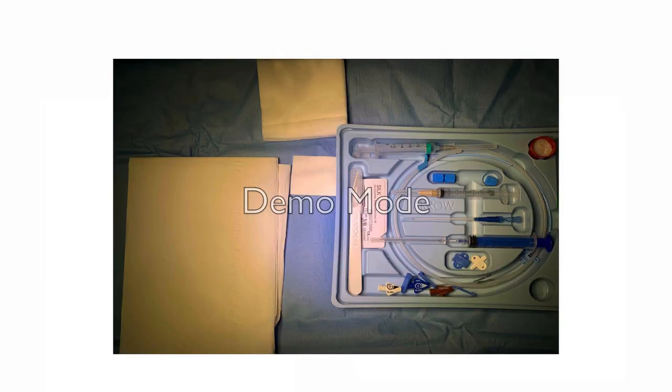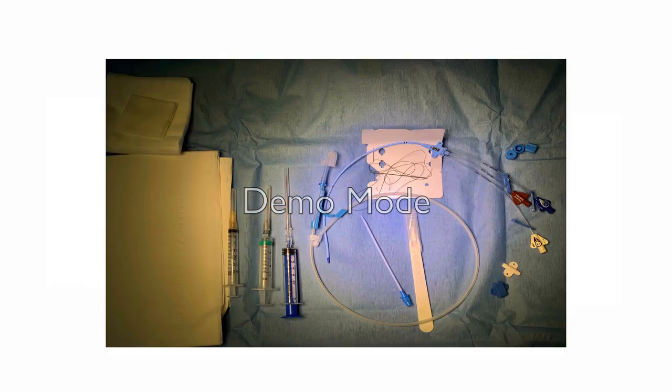Okay, once you open the kit, this is what you are expected to see. Empty all these over the table, and you will have 3 different sizes of syringes, one for the local anesthesia and one for the flushing, and the blue one for inserting the needle and to insert your guide wire through that needle.